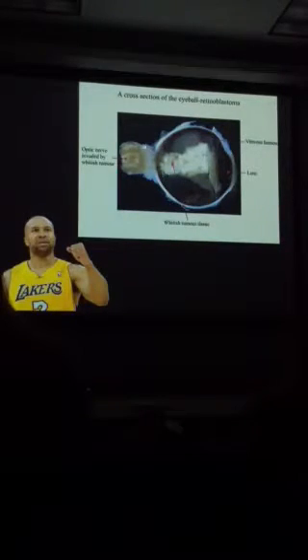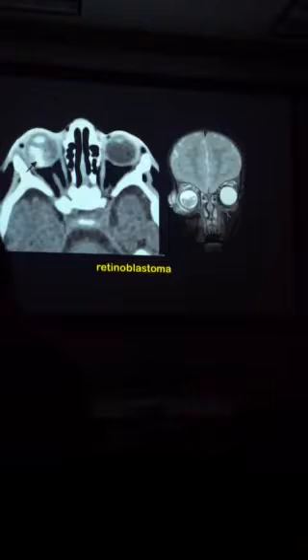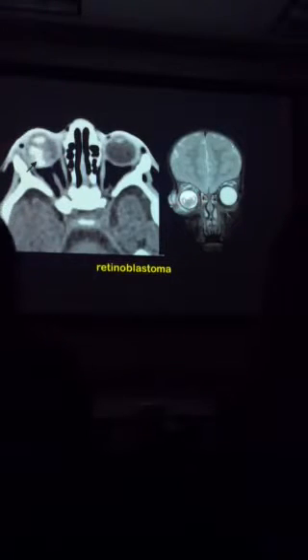So this is the optic nerve that's invaded by the retinoblastoma. It gets into the vitreous humor. They're pretty nasty. Spoiler alert here. This is a disturbing slide. No, not this one. Retinoblastoma. This is right up against the retina. It's a malignant tumor of the retina. Here's a coronal view. And again, it affects little kids. Babies are born with them.